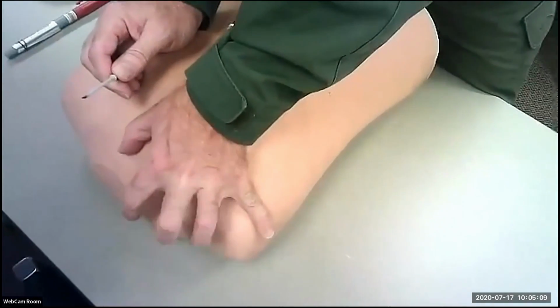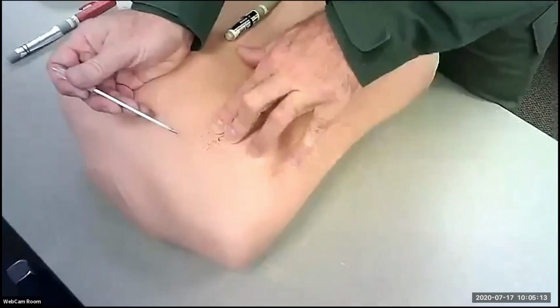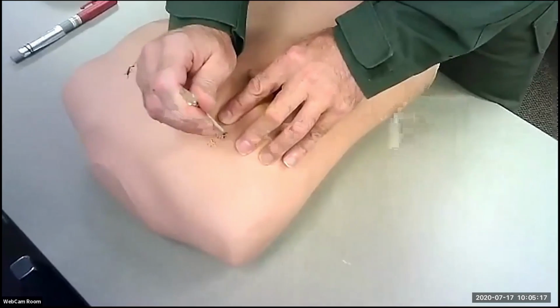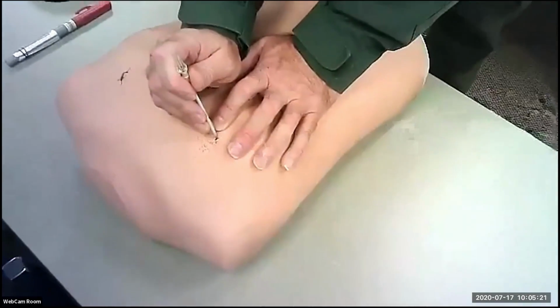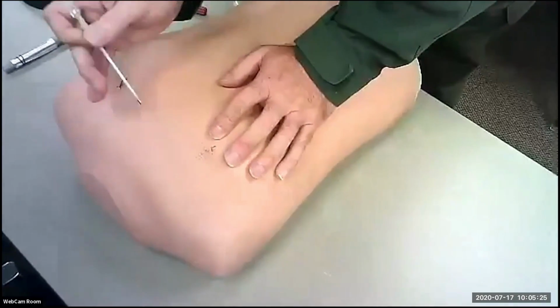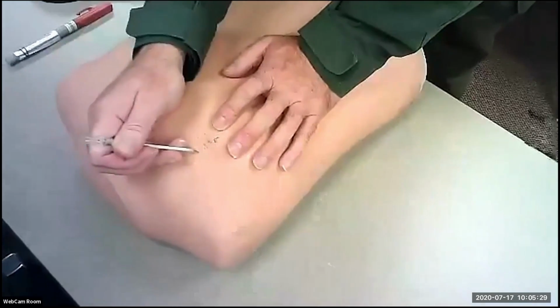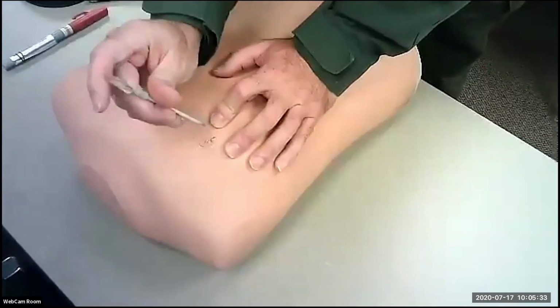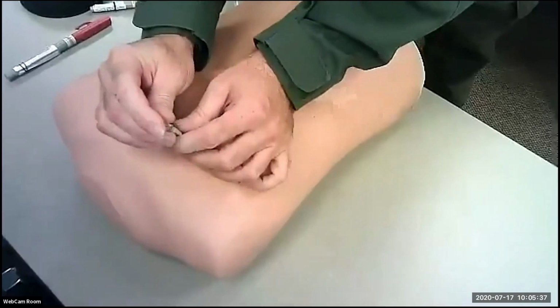So jugular notch out to the AC joint, drop your middle finger, roll it up. I'm feeling for that third rib, all right? I'm going on that third rib. People are going to ask, why are we doing that? It's imperative that you go up and over the rib, not to the second under it. Under our ribs lie arteries and veins, intercostal arteries and veins. If I nick that going in, I'm going to fill the chest full of blood. So it's to the third rib, up and into the second intercostal space, right?